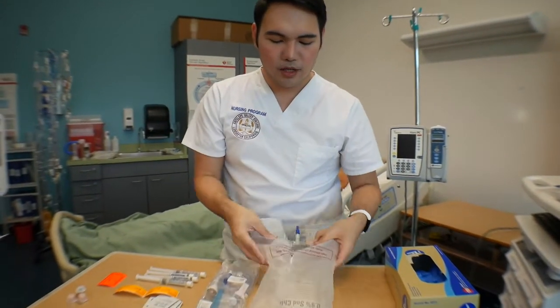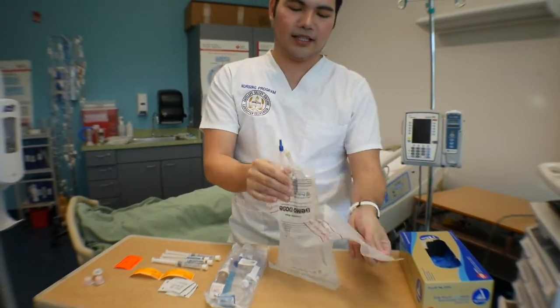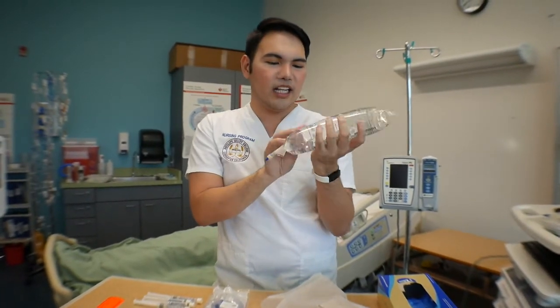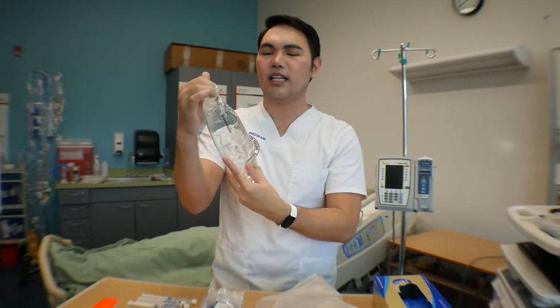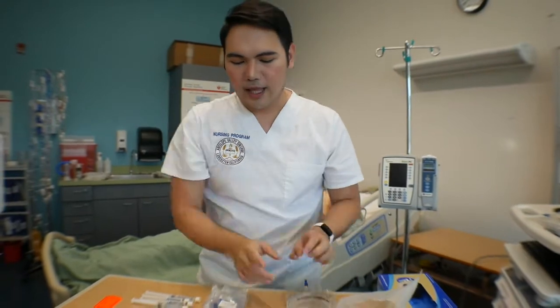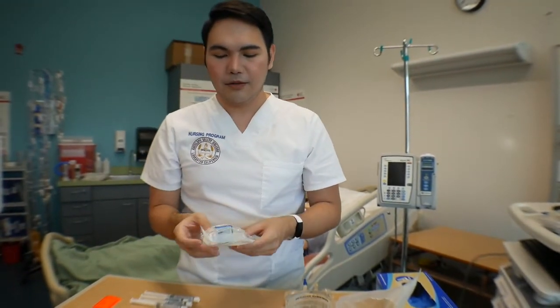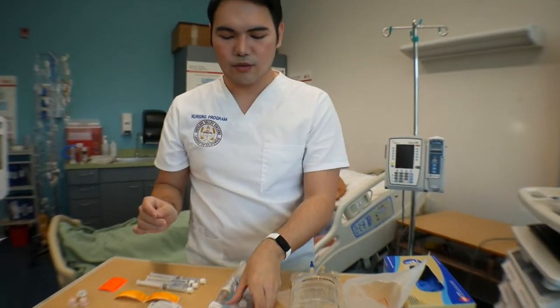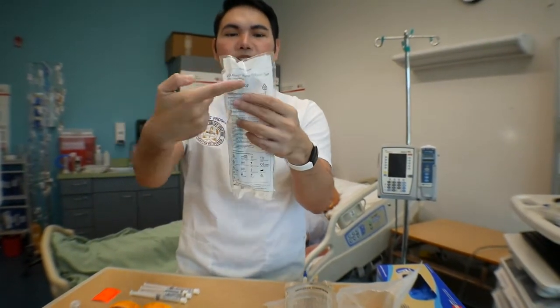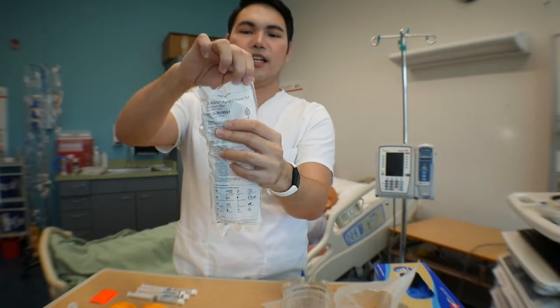I'm going to open the bag. It's already open. While you're opening it, make sure that it's not expired and that it doesn't have any puncture or any cloudiness inside. So this is good. Normal saline, if it's the right bag that you were ordered. After that, you're going to open your primary tubing. It actually has a line, so it's easier for you to tear it.